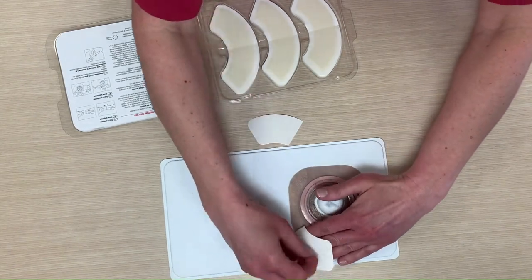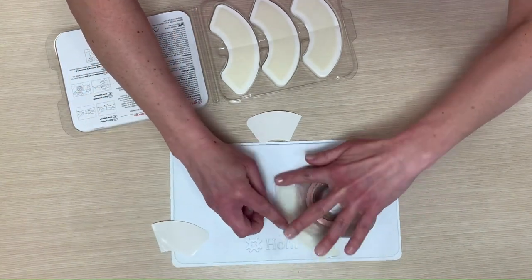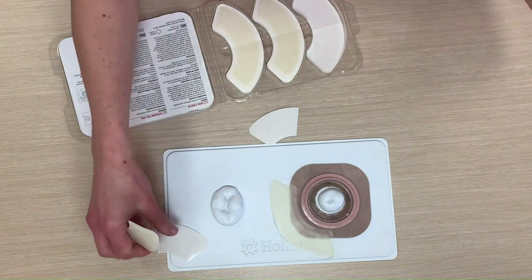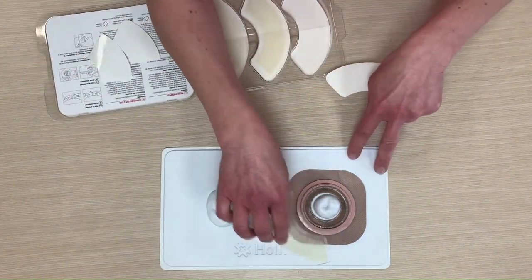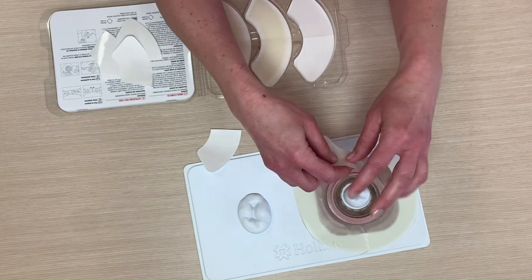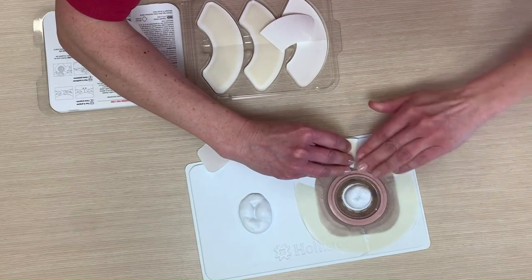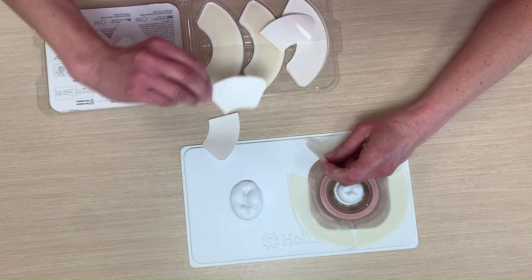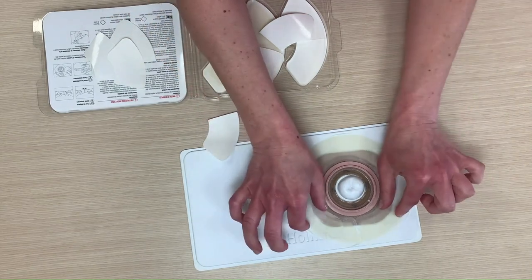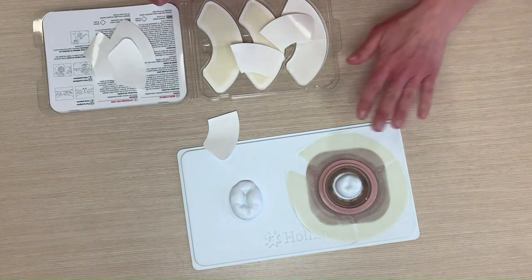You're going to adhere one side and then peel back the other, smoothing it as you go. Maybe you only need one side — perhaps you only need a little extra protection there. Sometimes patients need some on the bottom, just from gravity. You can see we just extended our surface area — and these are extra wide — we just extended our surface area almost double. That's a nice secure fit.